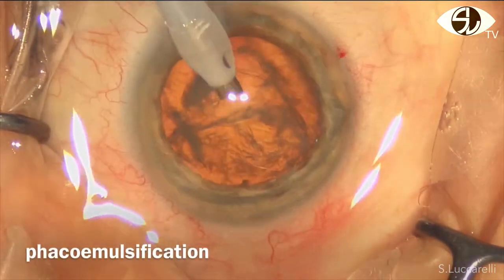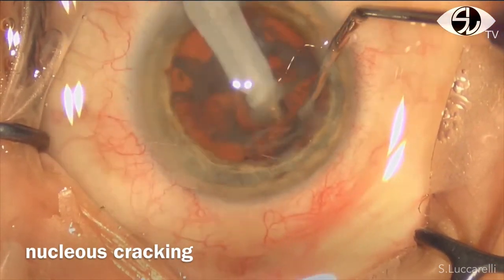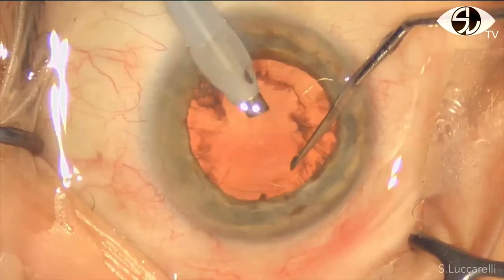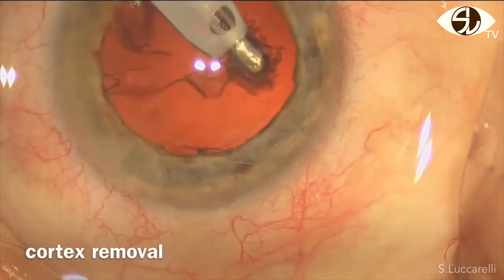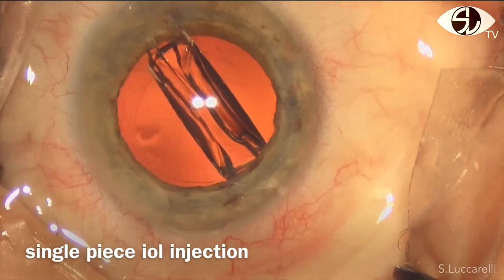Then, phacoemulsification with divide and conquer technique is performed. Cortex removal and injection of a single piece IOL follow.